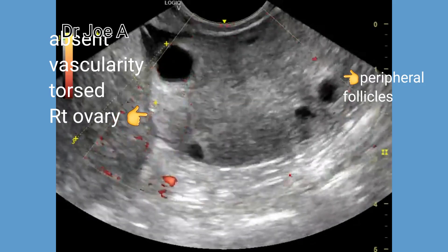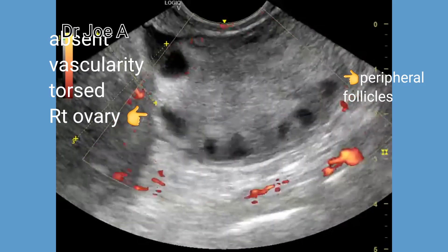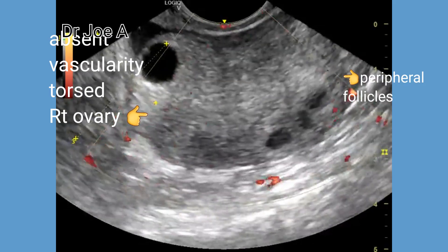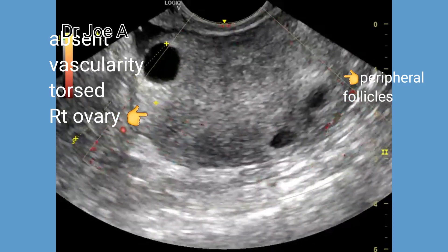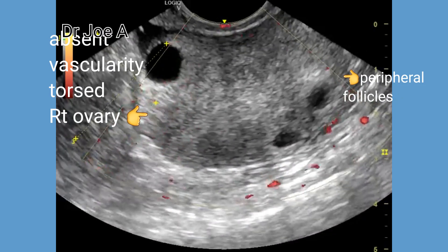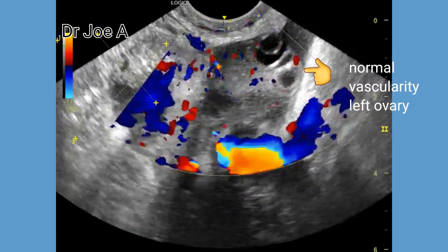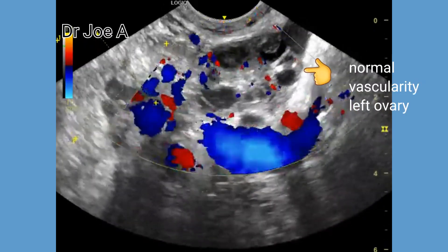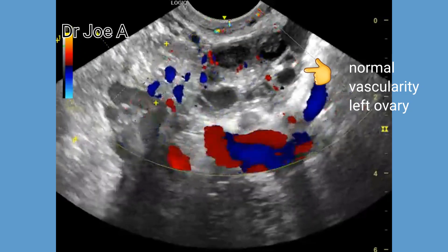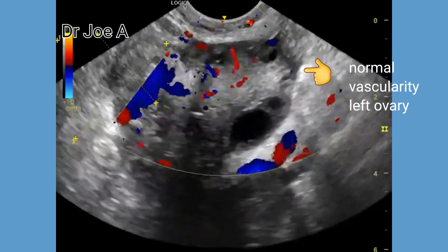In addition, we tried to look for the twisted pedicle sign. However, we could not identify the pedicle in this patient. The left ovary shows normal vascularity in contrast.